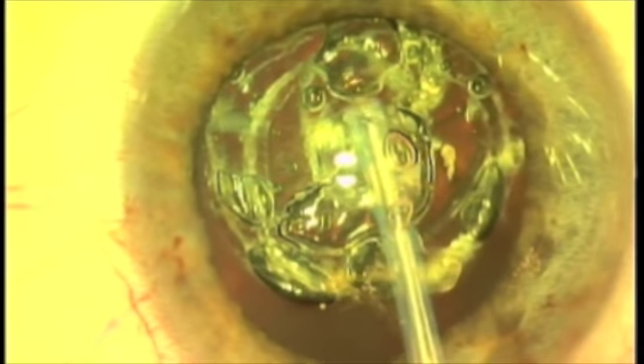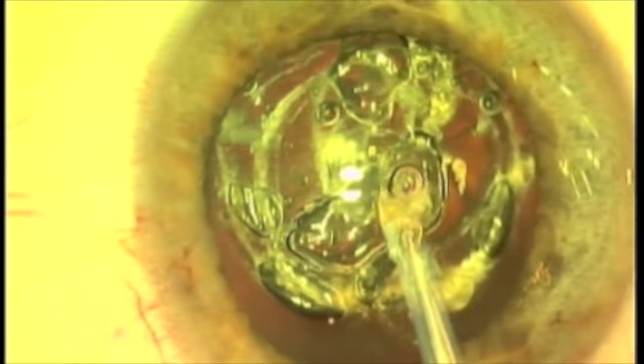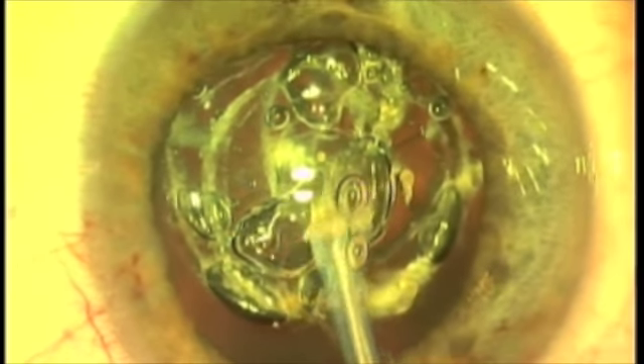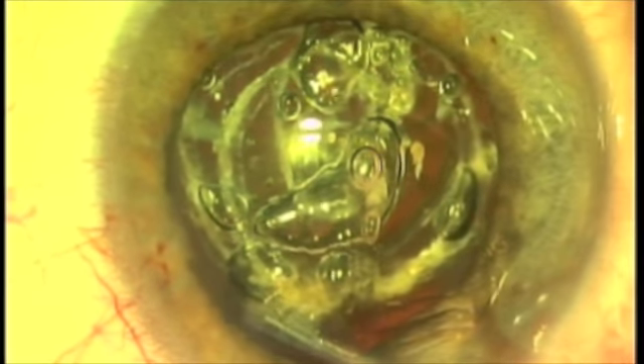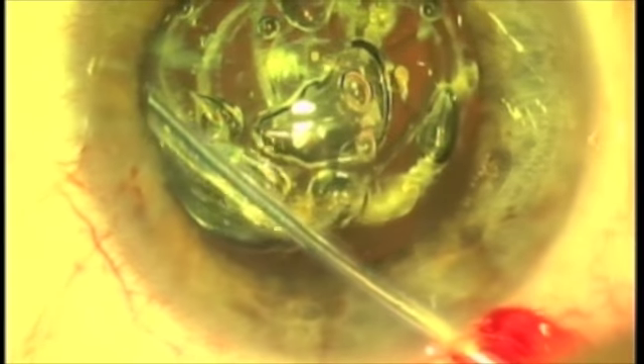Here we made a capsulotomy — a beautiful one — and then we used ablation to enlarge it, as you can see. Now we have this little crescent inferiorly, and I'm going to take part of that off.